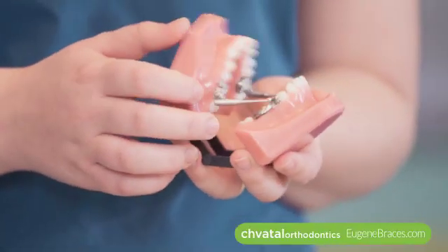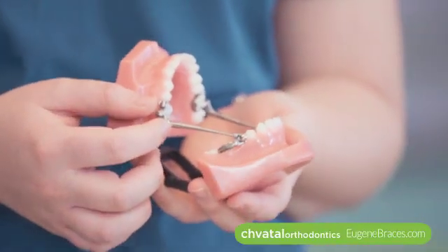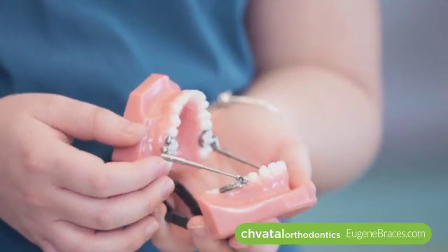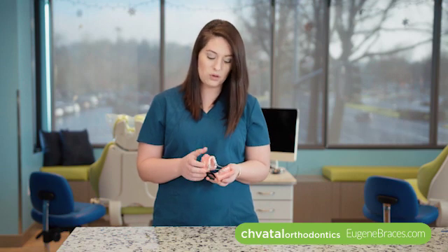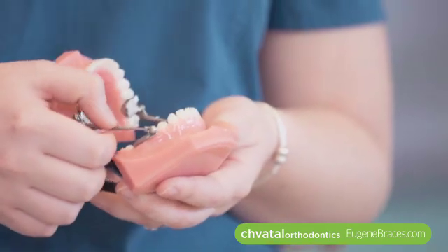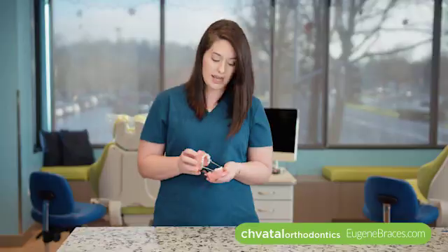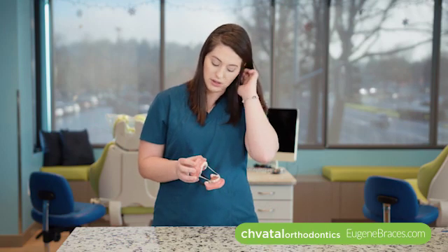The first thing I want to talk about is the arms. The arms are what attach the top jaw and the bottom jaw together and they're actually helping guide that lower jaw into place. Some of the problems that we see with these at home is that food can get stuck onto the arms, so you can either wipe it down with a cloth or give them a good brush with your toothbrush, and that should make it so you can close all the way.